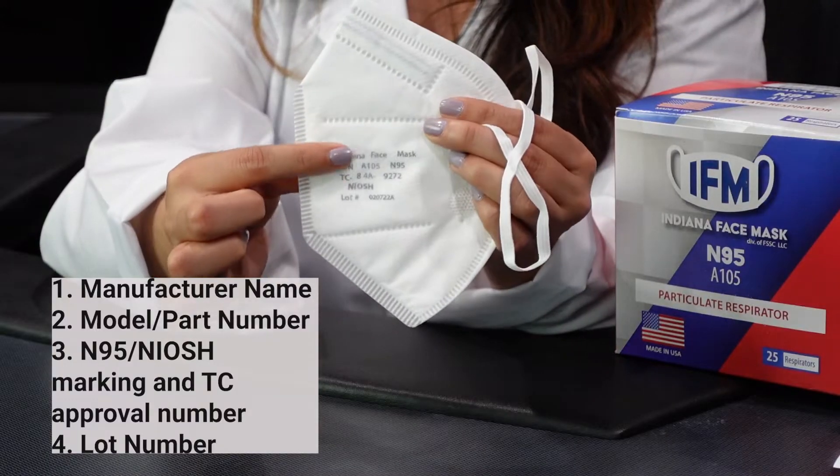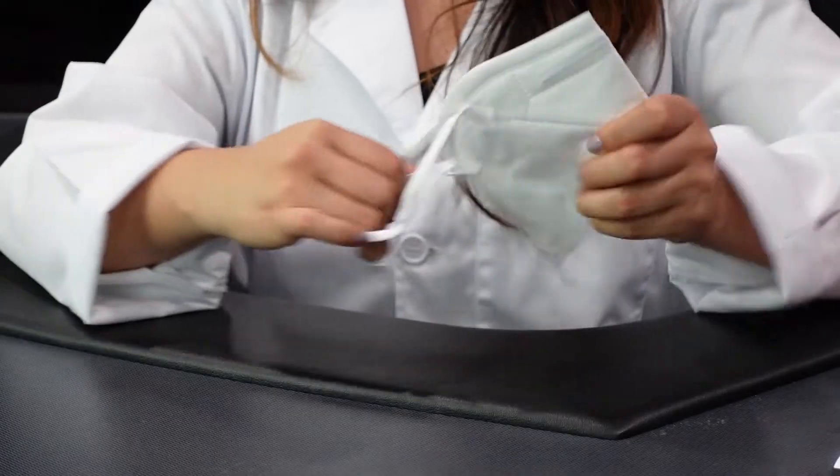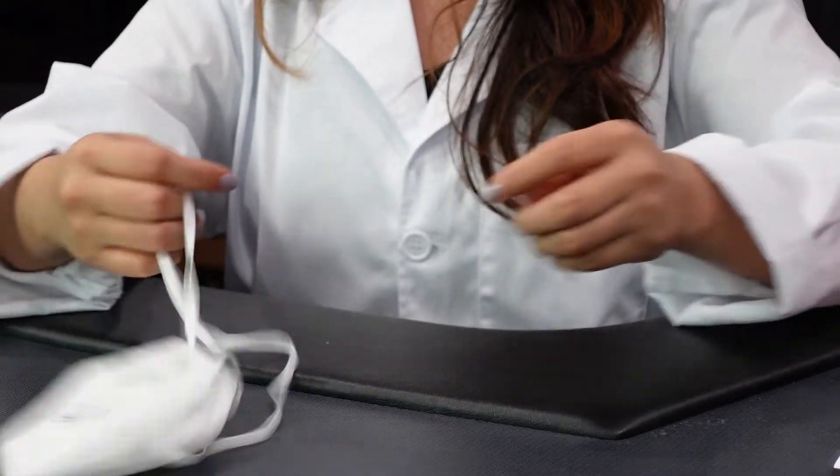On the face mask itself, it's printed with all the NIOSH requirements. I wouldn't go as far as saying that they are cheap, but there's definitely some room for improvement. One of these had been ripped, so I'm going to get a new one.